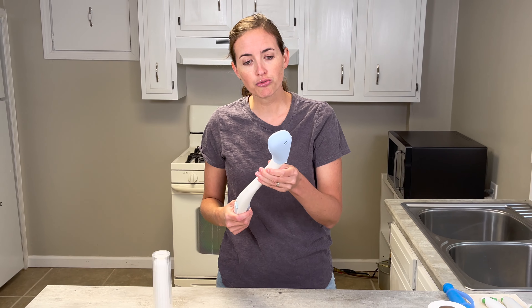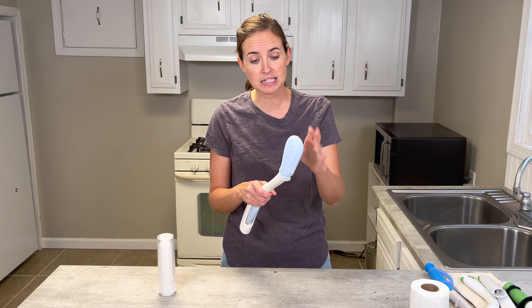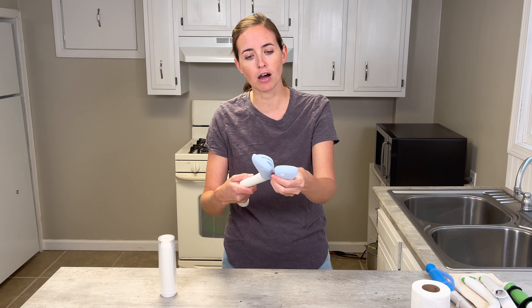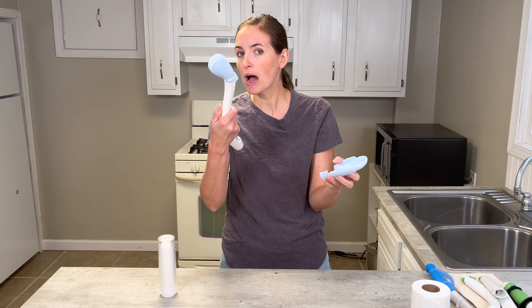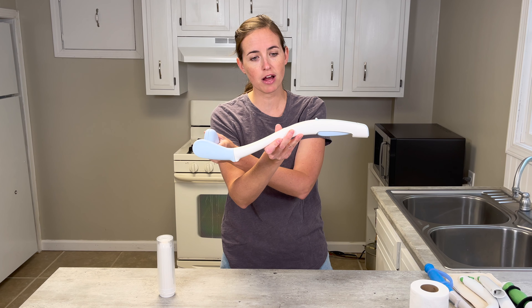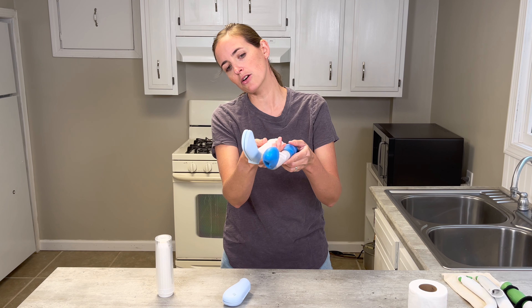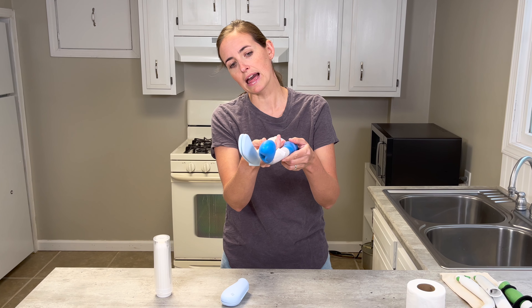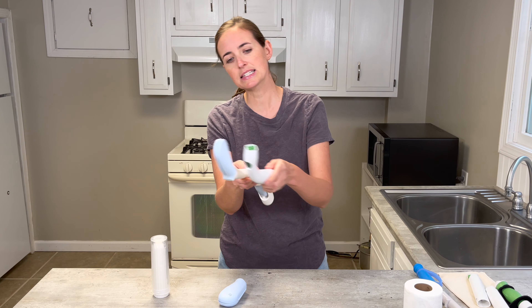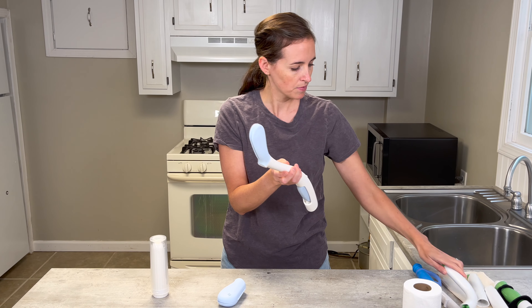Now let's talk about the Juvo. I love their products — I talk about their dressing sticks all the time. This is the Juvo; it comes with a head cover, which is a nice feature. However, it doesn't fold up. It's quite long, but I do like the curvature — it has a nice angle design, a bit more angle and length than the foldable one, and a similar angle to the Freedom Wand.